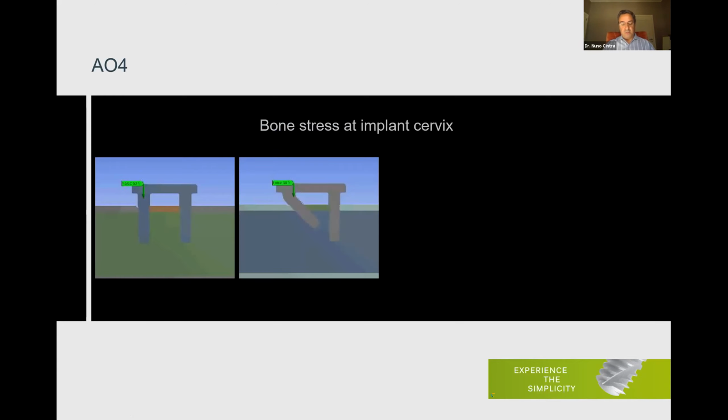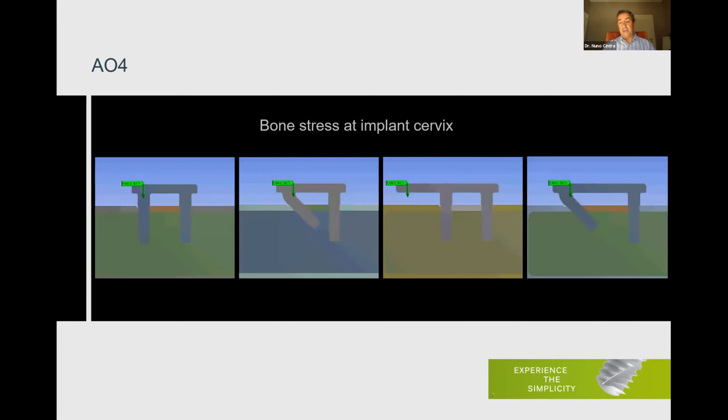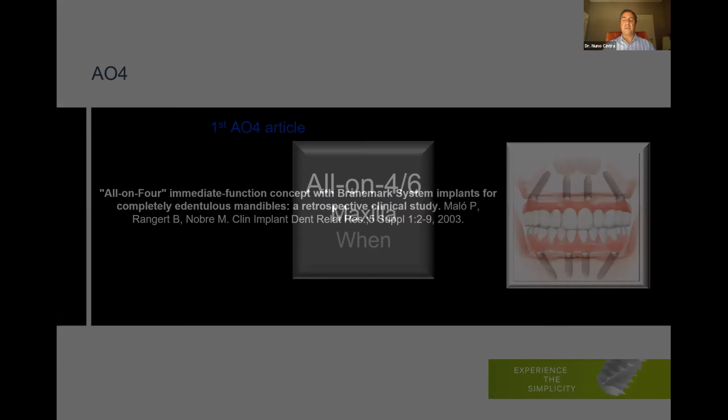What they did was compare straight implants with tilted implants, and then they increased the cantilever. And instead of a straight implant with a big cantilever, they moved the last posterior implant to the tip of the cantilever. They also compared the length of the implant, shorter versus longer implants. They came to the conclusion that the stress in the bone is lower when we tilt the implants instead. On these findings and others, in 2003, the first all-on-4 article came out with clinical studies made just on the mandibles.